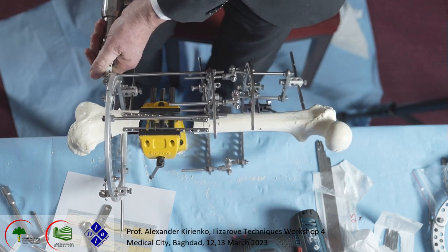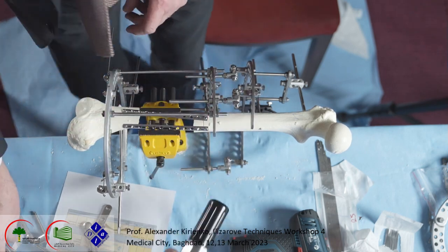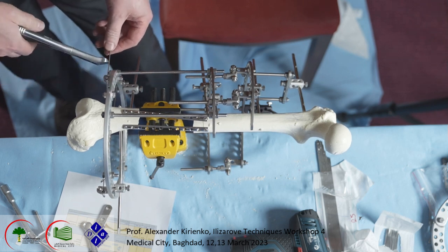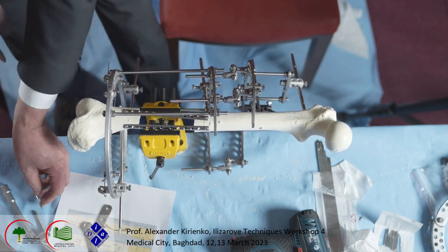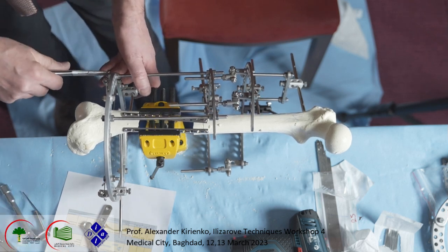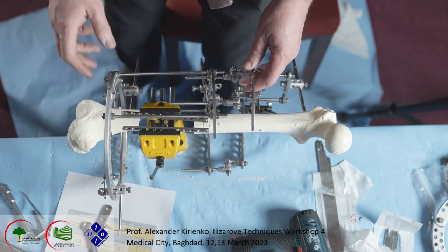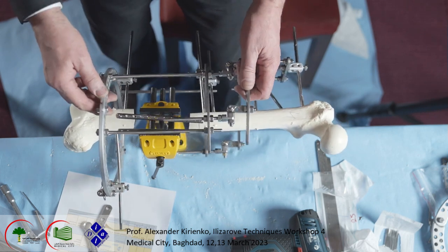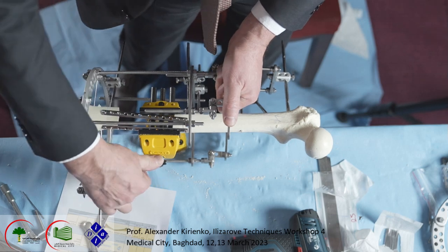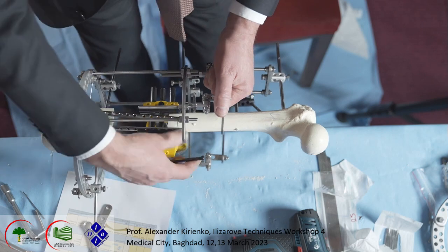Obviously, the patient in this clinical situation has just rigidity of the knee, because if there is infection, there is a defect, the patient doesn't move the knee really well. For this reason, it is important to achieve as much movement as possible during surgery. Okay, now our frame is ready. Practically we prepared everything for doing bone transport.